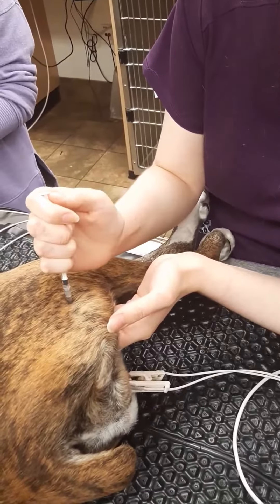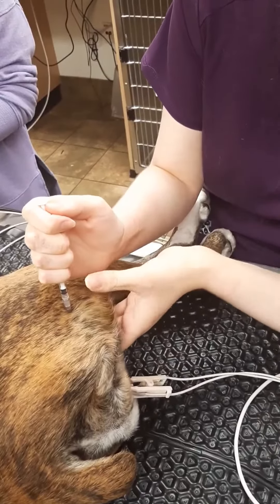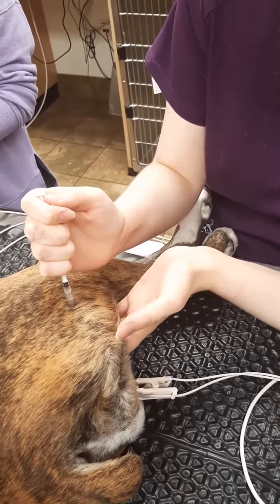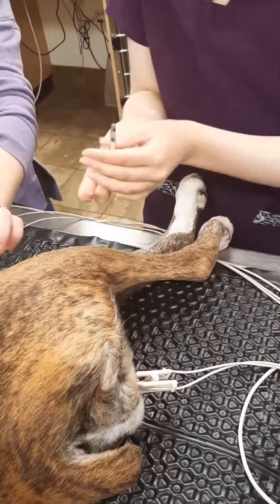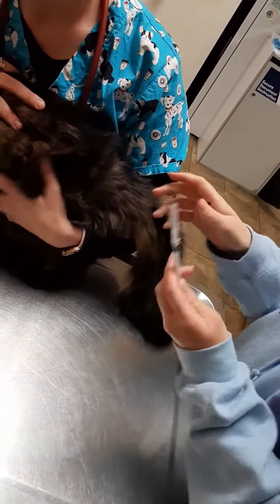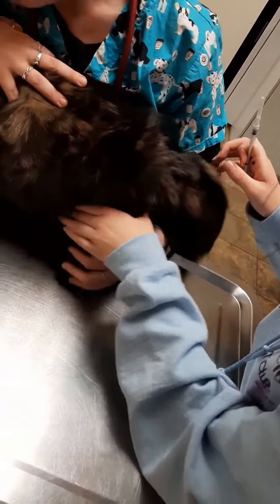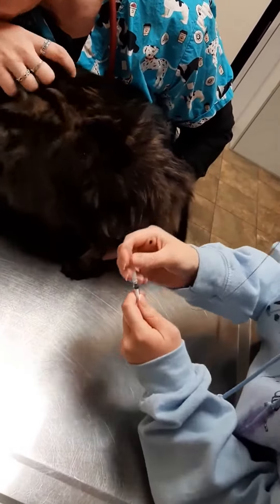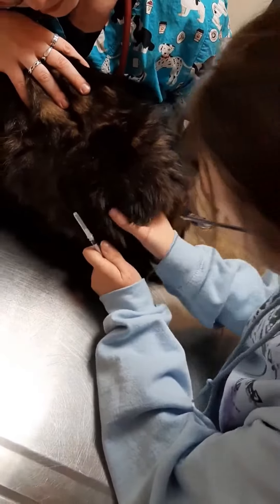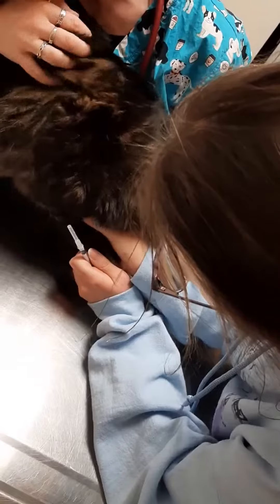Insert it and pull back and then give the injection, which I'm not actually going to do. This is an empty needle, but we're still going to show you this. So where is her leg? Let me see your leg — I can find the muscle. Jimbo, you're doing so good today.